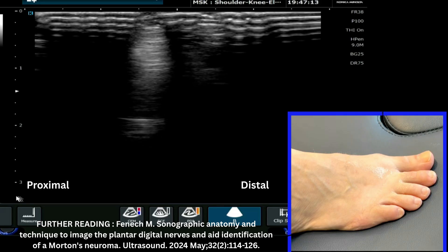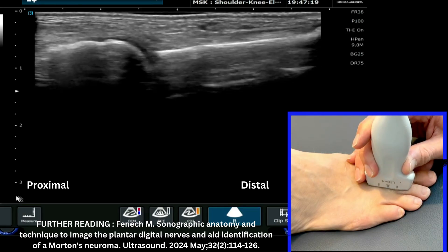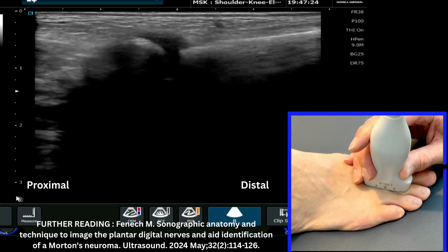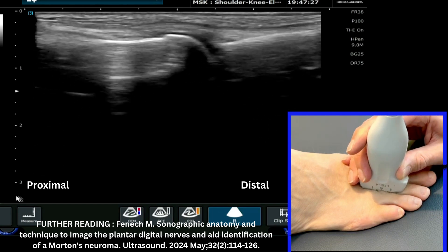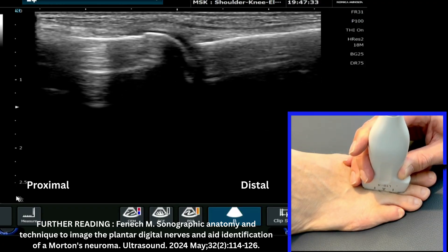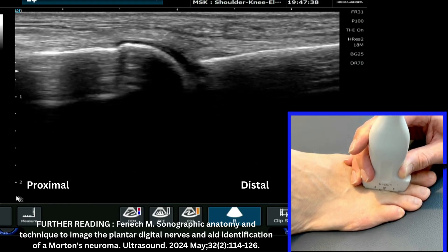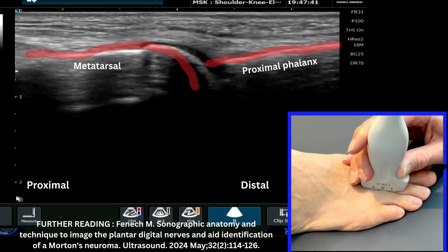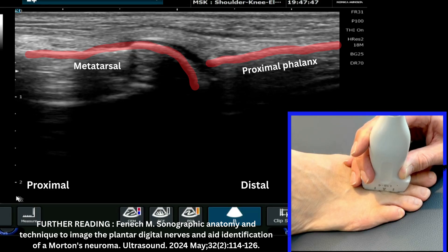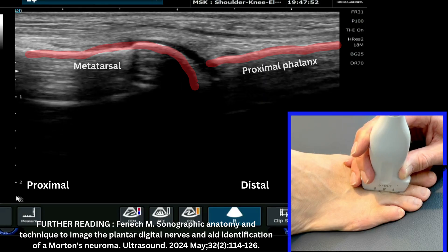I'm going to place my probe onto the dorsal aspect of the foot and start by scanning the dorsal aspect of the metatarsophalangeal joint. My depth is fairly well optimized — I could reduce it slightly, but not too much or you'll lose it on the video. We can see nicely the proximal aspect of the joint, which is the metatarsal, then the phalanx on the right of the image, and the extensor tendon on the dorsal aspect.